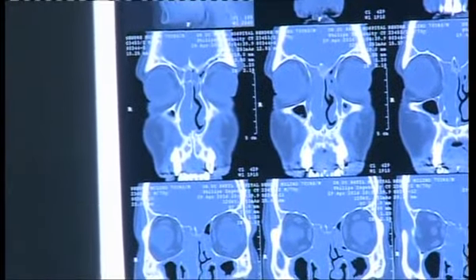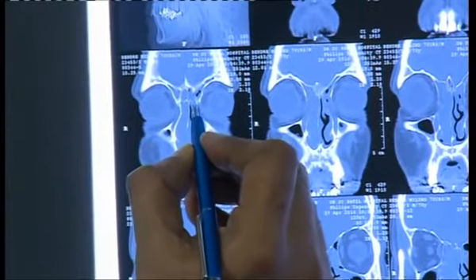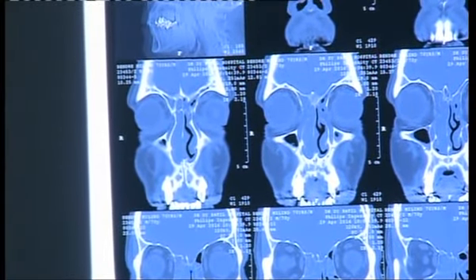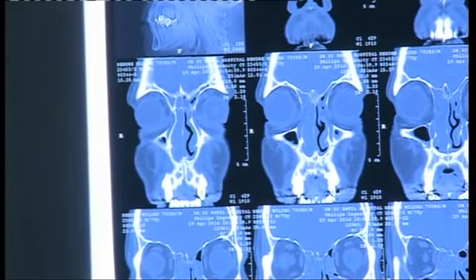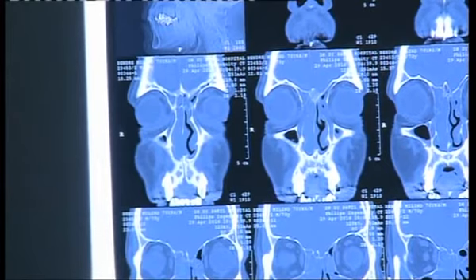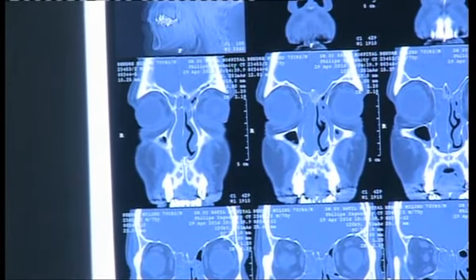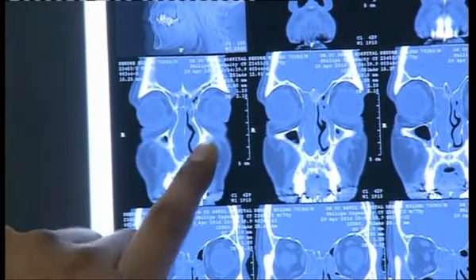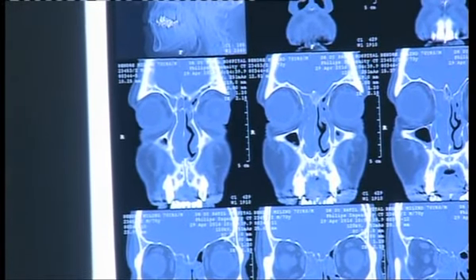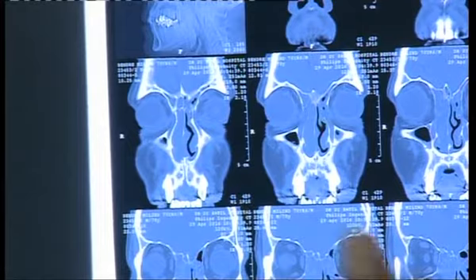Now you don't see any thick floor underneath the frontal sinus. Satish, correct me if I'm wrong. Are we supposed to see the agger cell before we see the maxillary? Yes, we are going to see it. Maxillary means this is the anterior most, the anterior wall just of the maxillary. The picture almost is not tilted. Just the bone appearing. Okay, so the agger is going to be coming now.